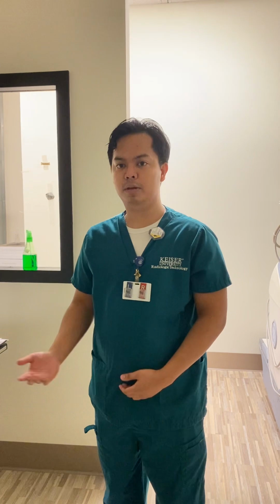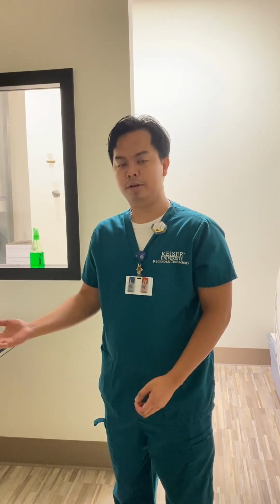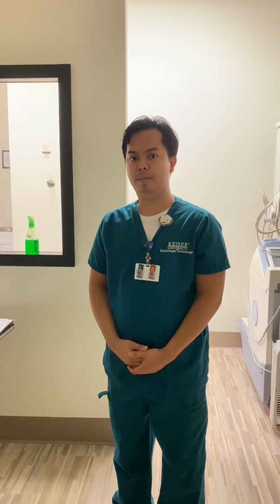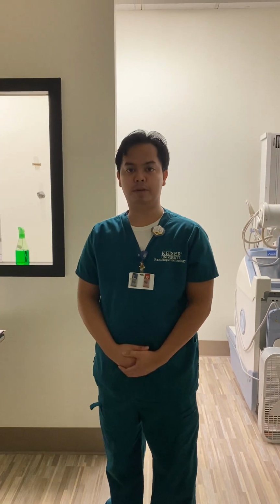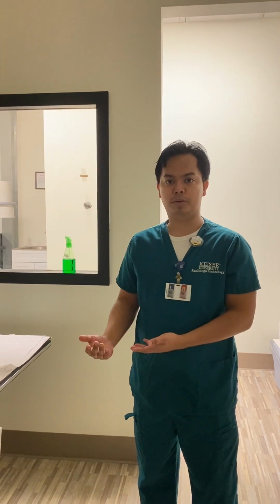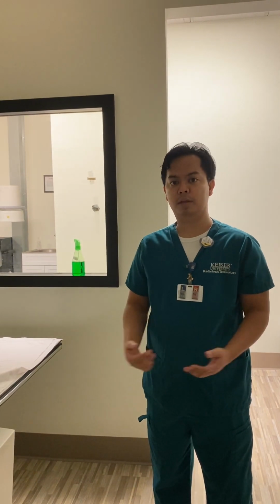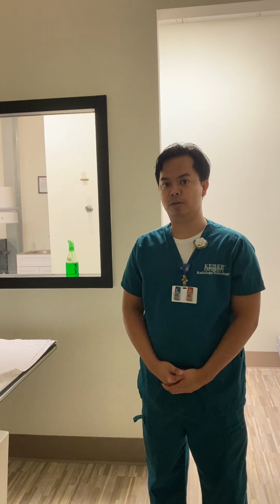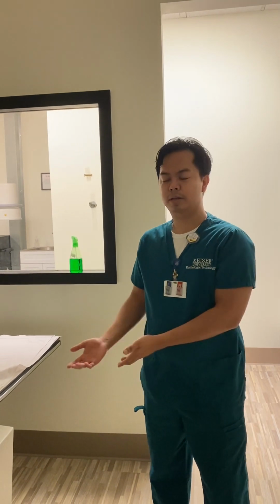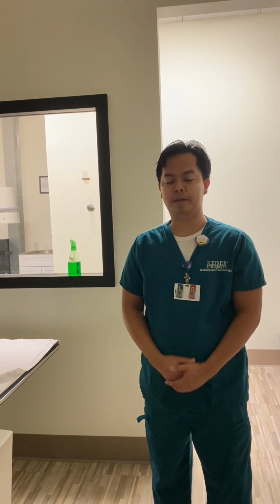So I'm JB Carpio. I'll be your tech today, and I just want to call out their first name and last name, and then I'll ask them for a date of birth. Once I get that, I check the wristband to make sure, and then I'll take them to the x-ray room. Once I take them to the x-ray room, I'll explain the x-ray itself. It's going to be the AP Lordotic supine, and then start our history.